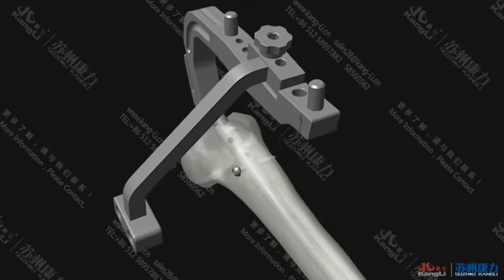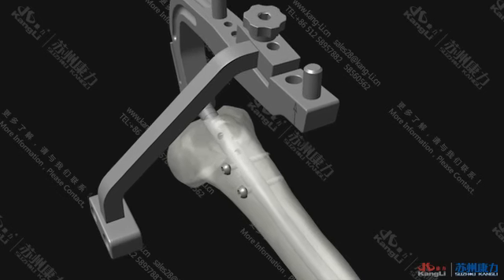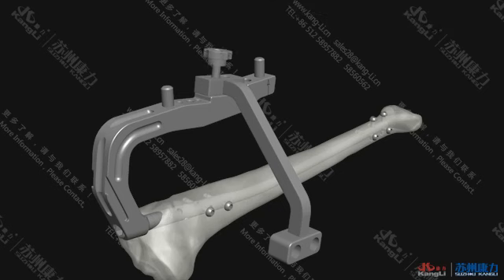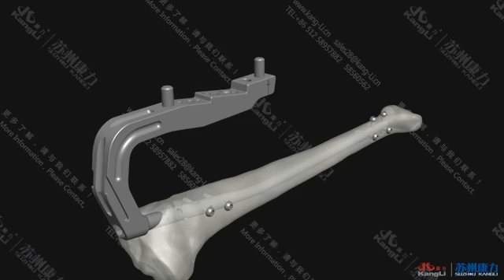Repeat the steps described above to finish the placement of the second locking screw. Remove the proximal targeting bracket. 3 phi 5.0 locking screws could be placed at the proximal end of the nail of the KTO Tibial intramedullary nailing system, according to the requirements by the type of the fracture.